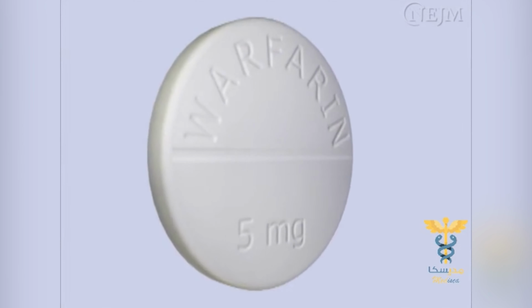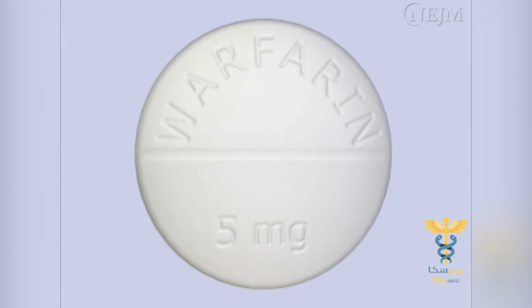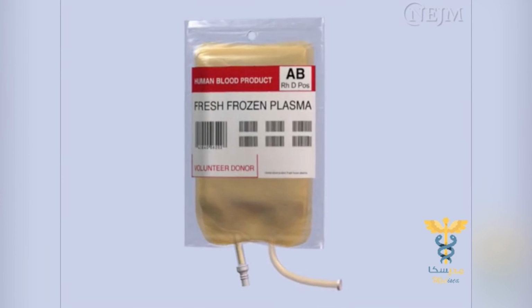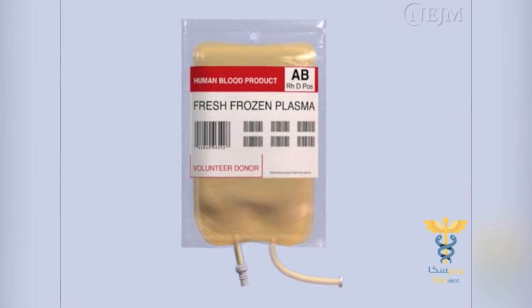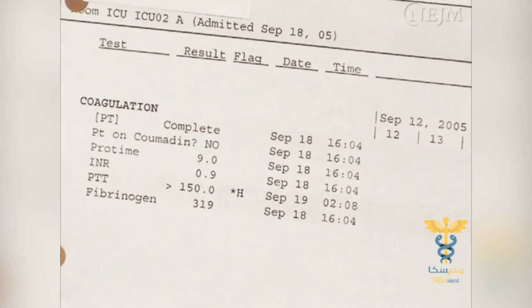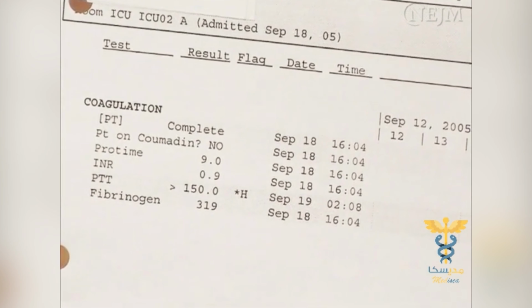Limited data exist regarding the safety of thoracentesis in patients with coagulation abnormalities. The procedure is probably safe in patients with mild or moderate elevations of the prothrombin time or partial thromboplastin time. The decision to use fresh frozen plasma or platelet concentrates in patients with clinically significant coagulopathy or thrombocytopenia must be made on an individual basis.